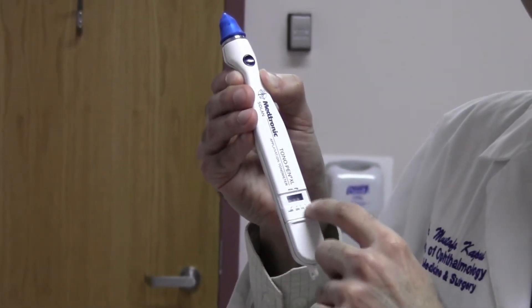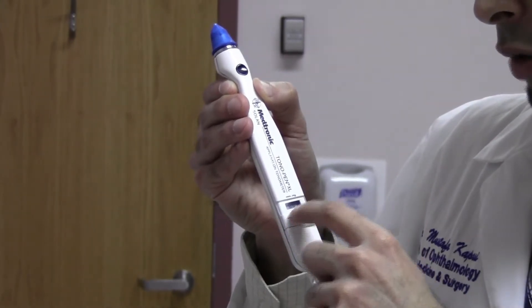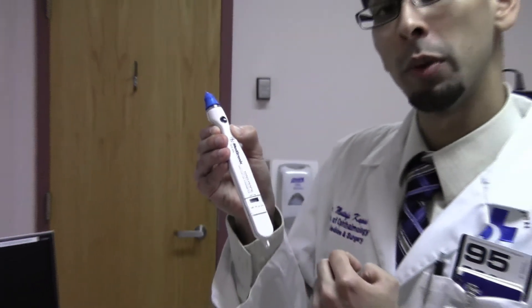The standard error should be 5%. If it's greater than that, the measurement should be redone.